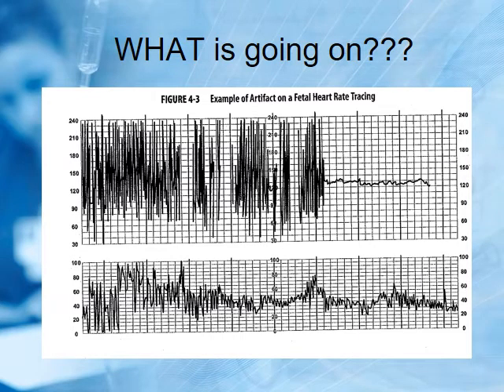All right, what's going on here? This is artifact. This is a loose wire. Don't panic. This just needs to have somebody go in and put a new one on. That's just a loose wire. Artifact. Scary, unless you know it's just machine artifact.